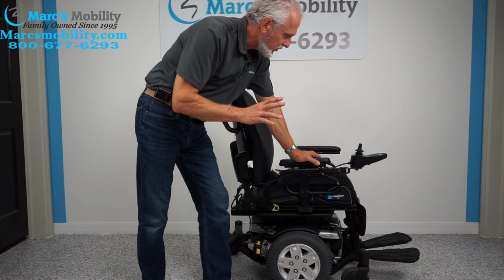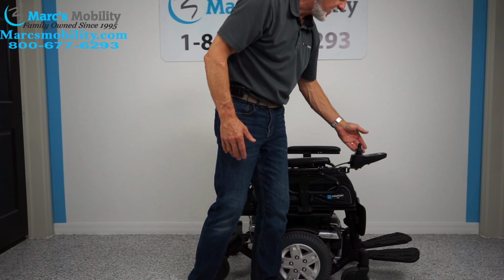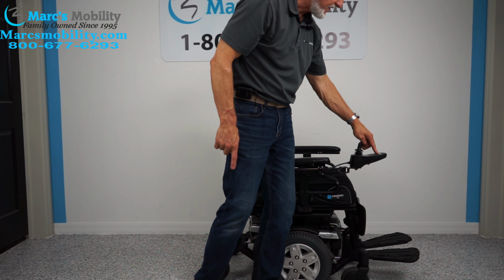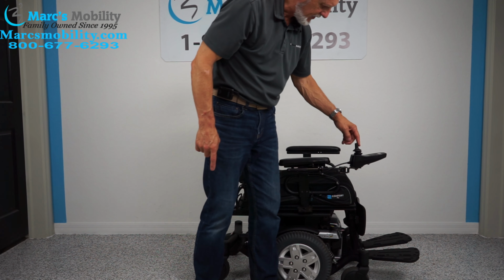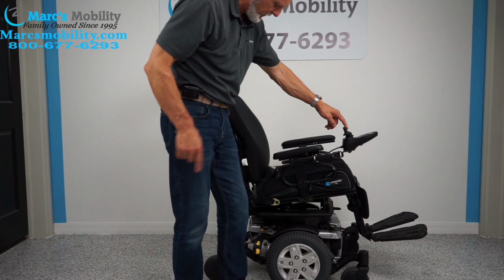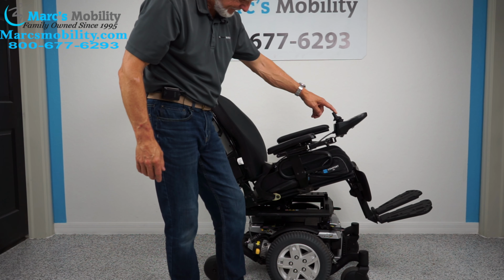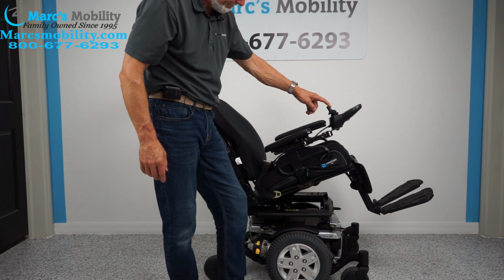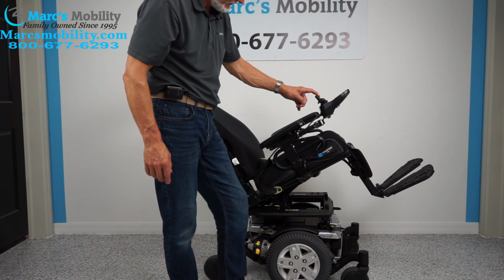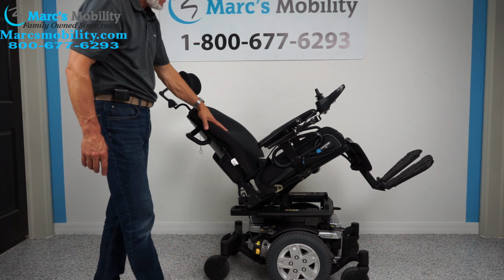Okay, so we're going to show you the function right now. So the first function you have to do through the joystick is hit the blue button until you see a picture of the seat on your screen. When you see a picture of the seat on your screen right there, then use your joystick and go back, and you can see your electric tilt going back. So let's see how far back this is going to go. This is called your electric tilt. All right, this is as far back as it'll go on the electric tilt.